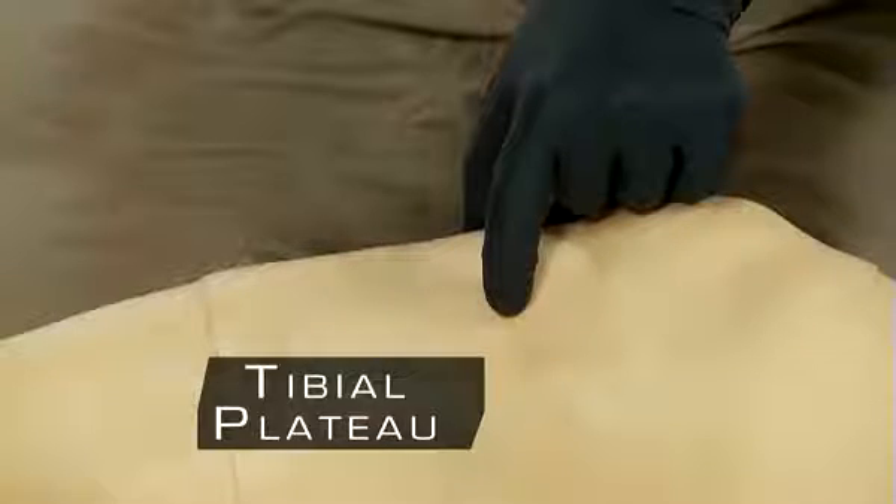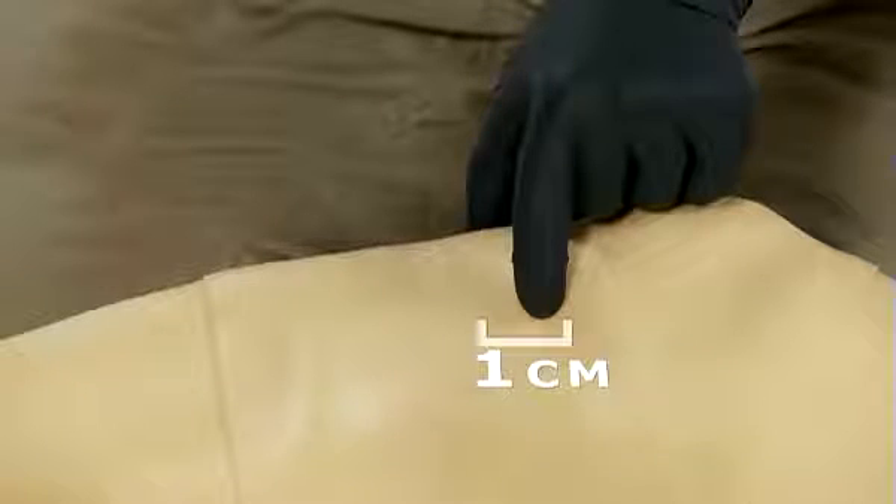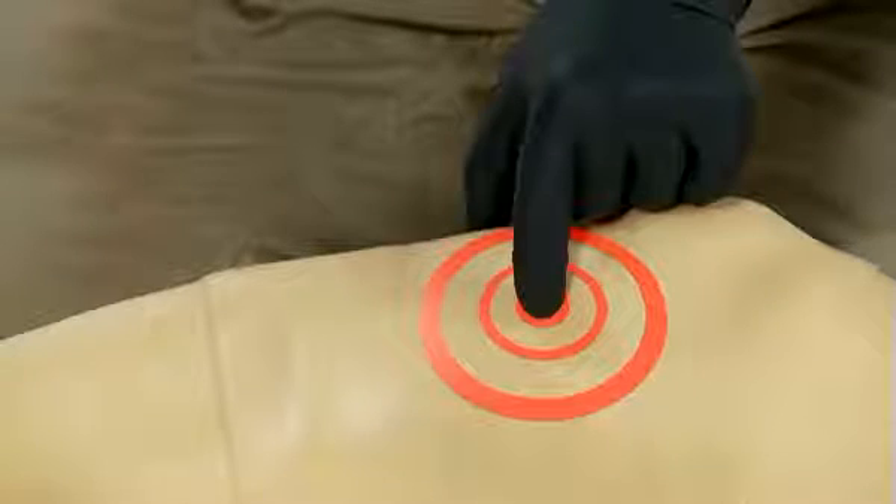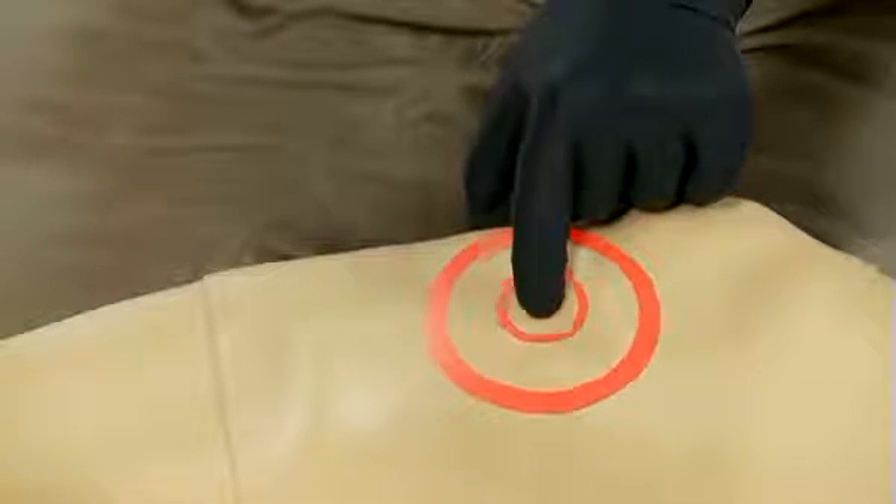This flat portion is called the tibial plateau. From the tibial plateau, go up approximately 1 centimeter, or a half an inch, toward the patella. Our goal is to deploy the needle through the thinnest portion of the cortex and in the area that contains the highest vascular content.